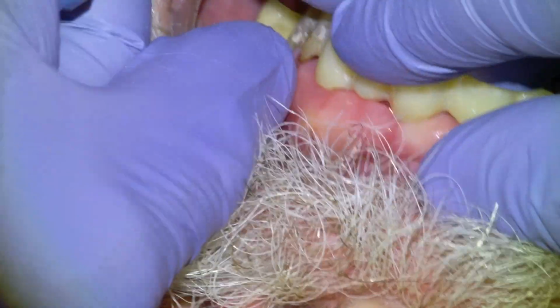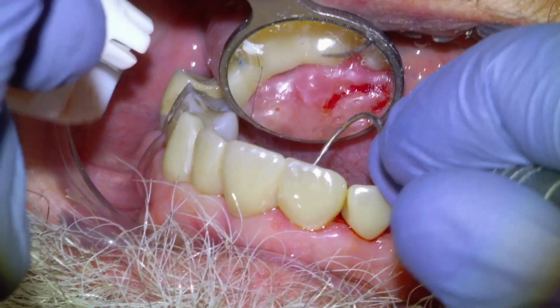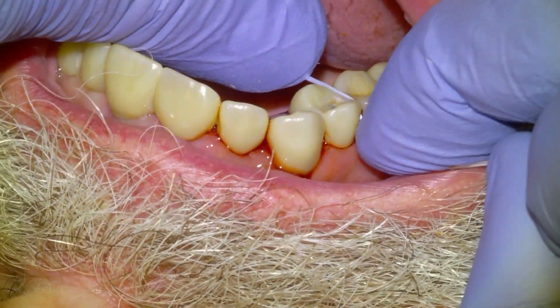Bridge goes in. This was an immediate bridge. We actually make it a week after we've extracted the teeth. I just have my designer extend the pontics down into the extraction sockets, and I've had good success with that. And then that is this case.